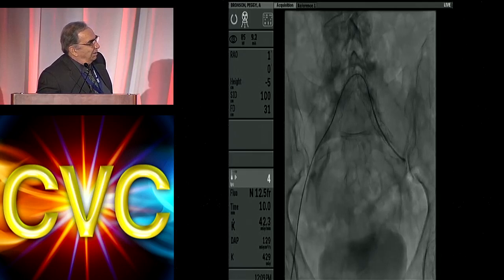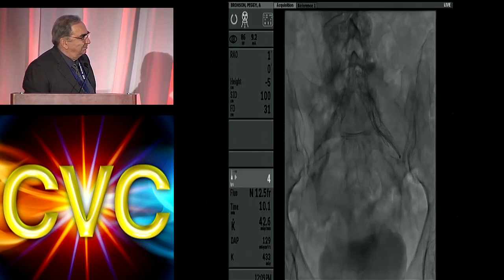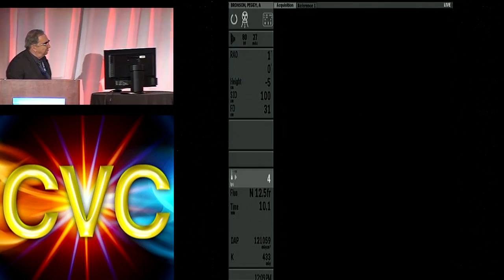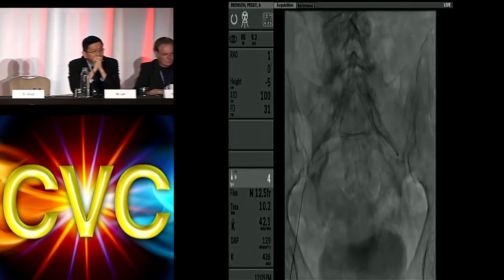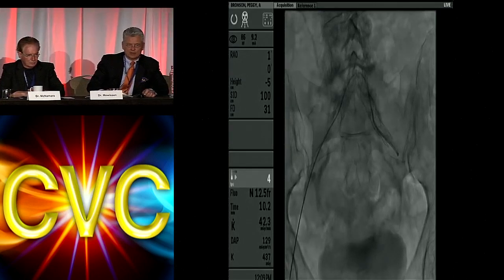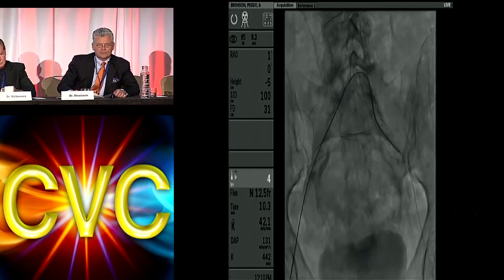Any of you on the podium? Mark? I have a short 5 French sheath and a pigtail catheter on the other side, and I cannot remove it.